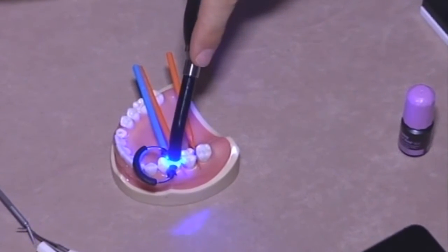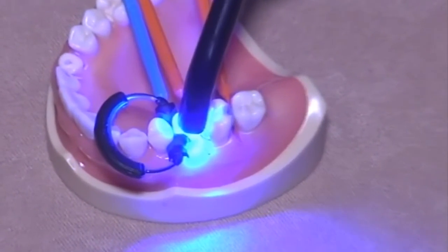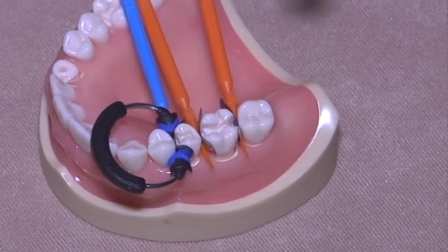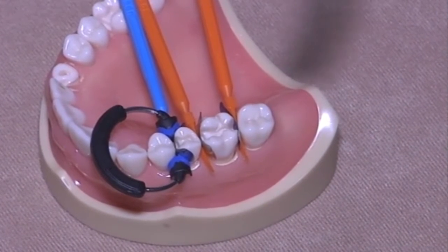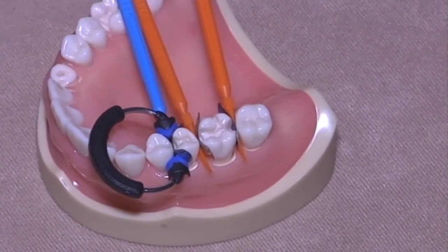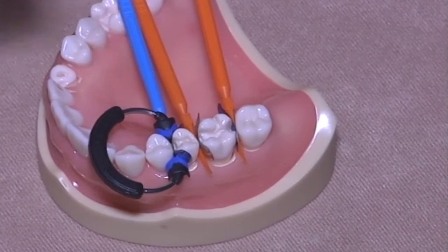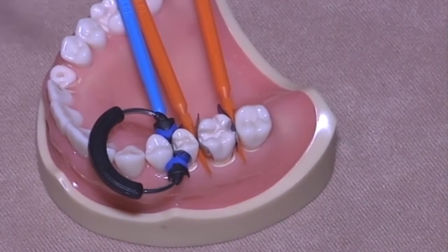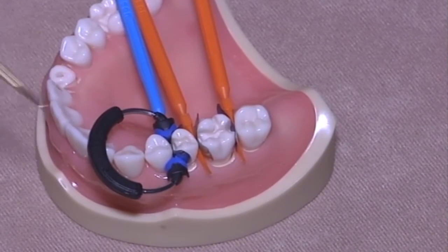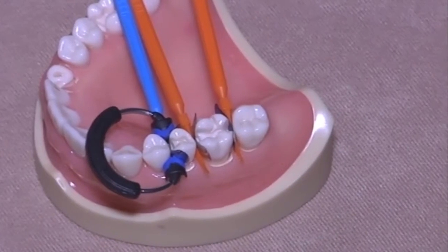light cure, and remember that because of the distance between the curing tip and the bottom of the cavity, the step that needs the longest curing time is the adhesive curing, because it's the part of your restoration which is farthest away from the tip. So it's better to cure the adhesive 10 seconds more, since the composite is going to arrive in a while.